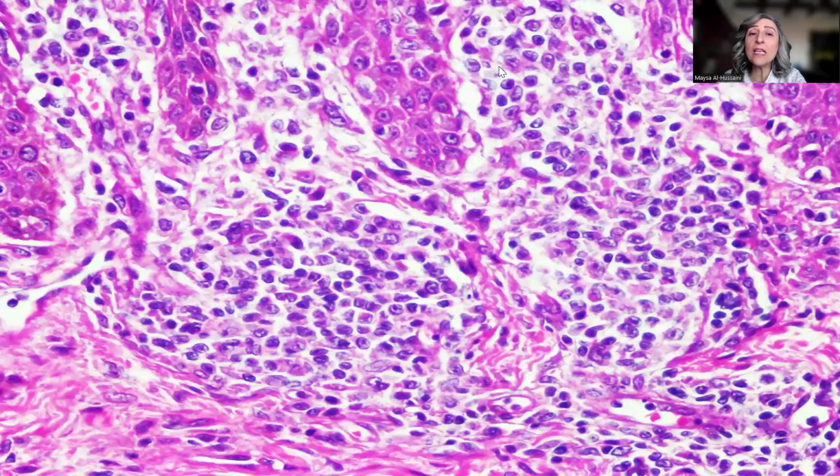And now zooming into the upper dermis, we can see that the infiltrate is kind of monotonous. The same cells are repeated over and over. And to be honest with you, perhaps the first thing that would come to mind is something else other than mycosis fungoides, because we don't see the usual cerebriform nuclei that we usually encounter with mycosis fungoides. Rather, one of the things that we should think of is perhaps this is some other kind of cutaneous T-cell lymphoma.